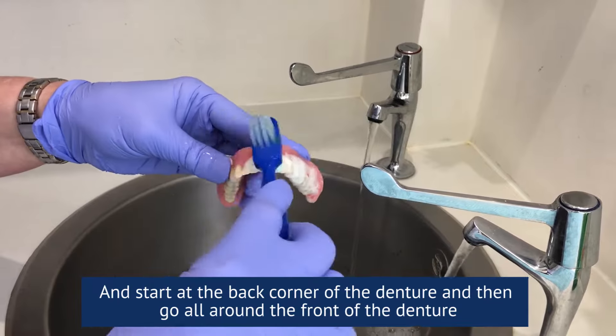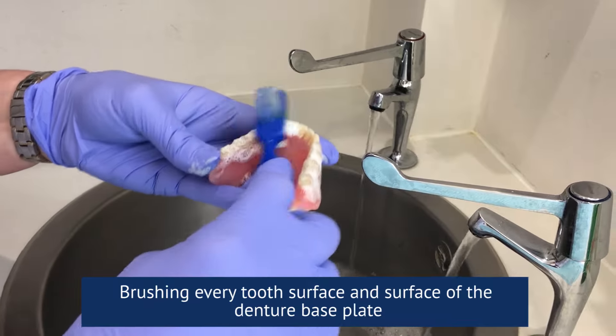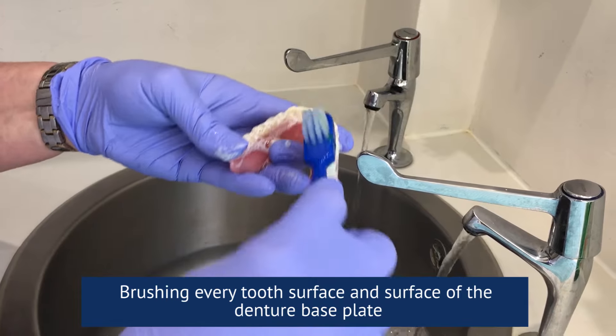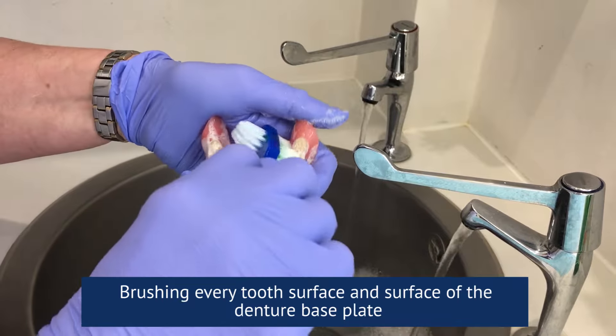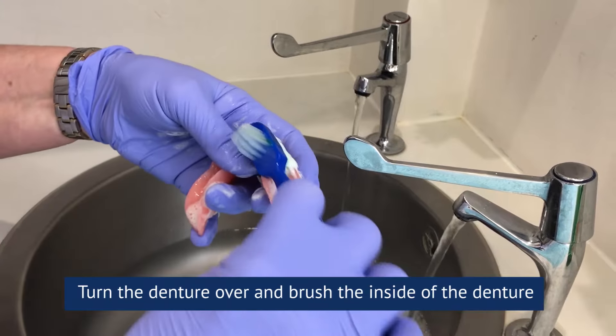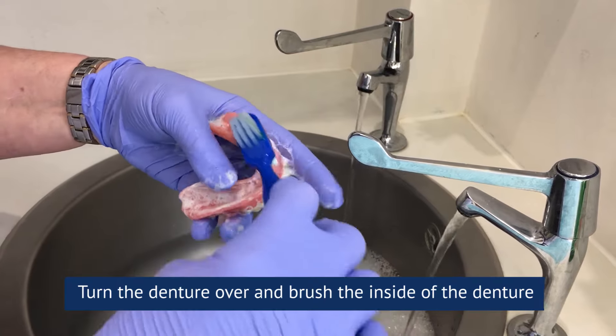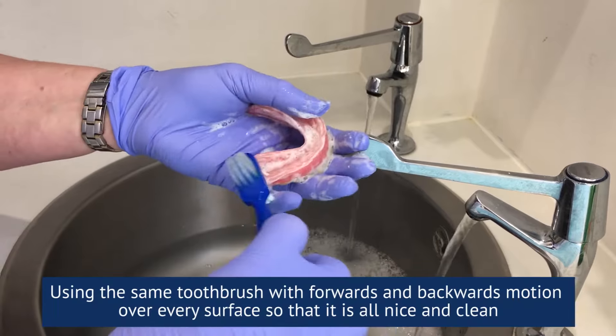Go all around the front of the denture, brushing every tooth surface and surface of the denture base plate. Turn the denture over and brush the inside of the denture using the same toothbrush.